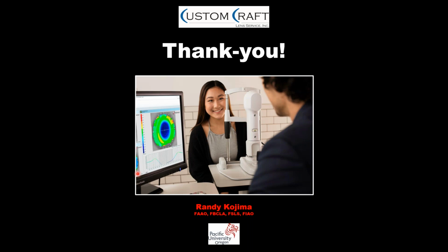Thank you, Darren. And there is a question, is it possible to decenter the treatment zone? At this time, oh, go ahead, Randy. No, I was going to say, did you want to field that from an EyeSpace perspective? Yeah, at this time, it's not possible, but once we have the confidence of the topography being centered with the majority of our users, then that may be a feature that's introduced.